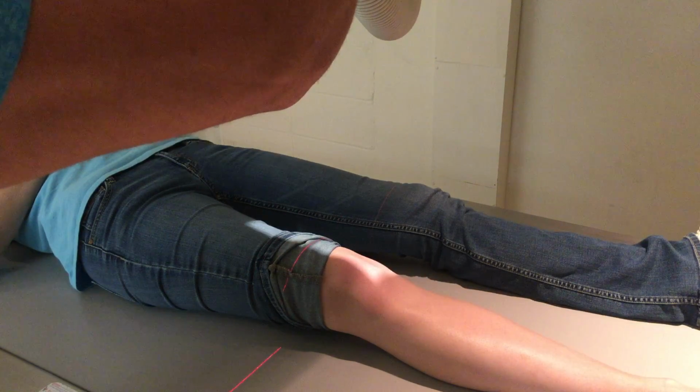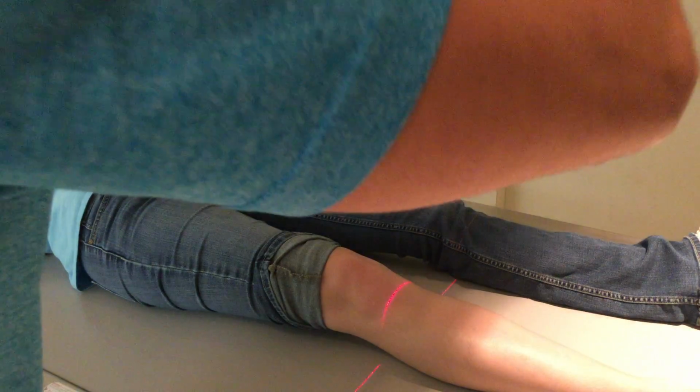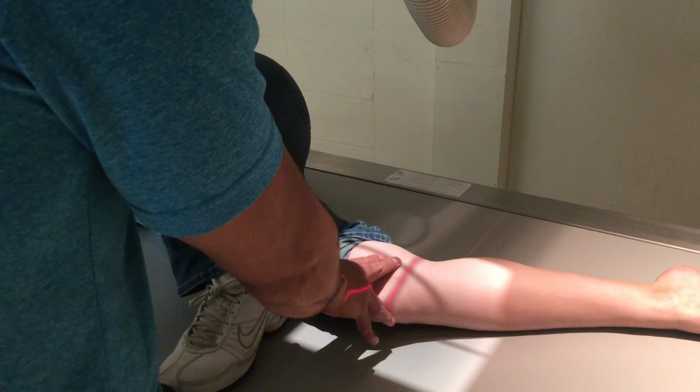So again, like I said before, 5 to 7 degrees or so on this. Let's say 5. And we want to make sure we're nice and lined up with our bucky again. I don't think you guys can see that, but that's okay. And this one's awkward. So you ready? All right, I need you to roll all the way up to your right side. Bring your left leg in front of you, if you would. Just like that. Then you're gonna lay this leg all the way out and bend your knee about right there. Perfect. And this is like, okay, pretzel time, right? All right, so then you just want to be about an inch below the condyles here, right there.